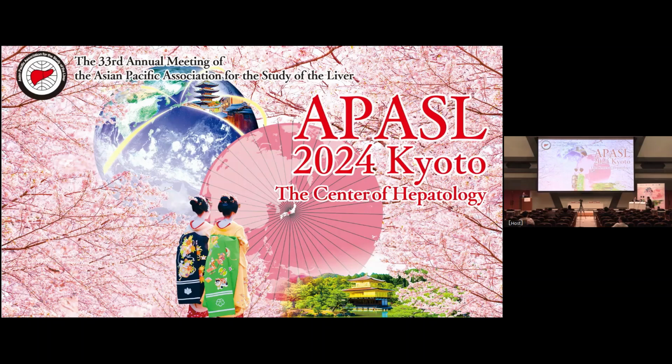So Professor Hara, in the video, I think most of the puncture videos use a Fujifilm EUS, but you also prefer forward-viewing EUS. Is there any role for liver puncture with forward-viewing EUS?